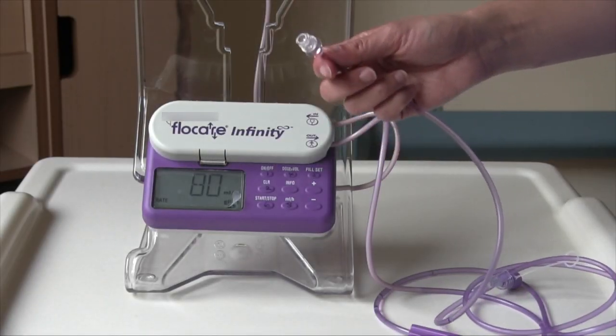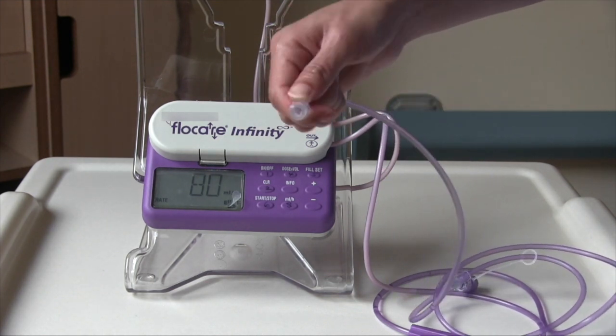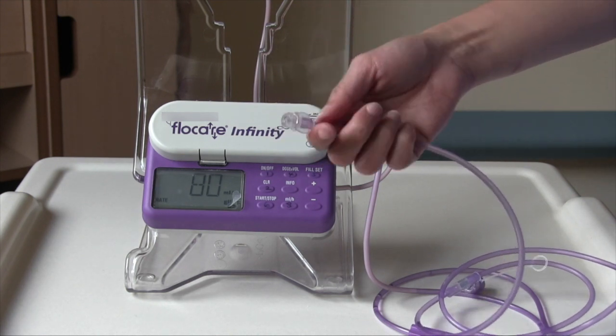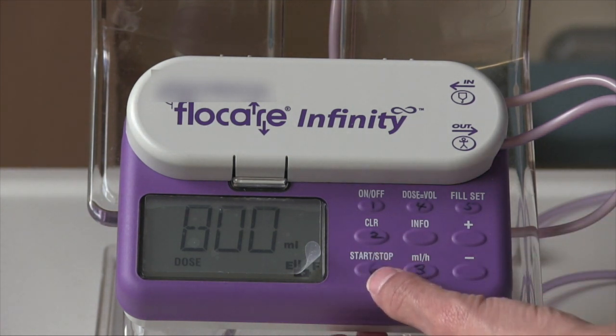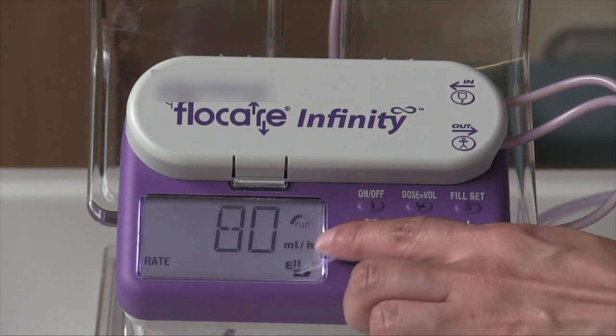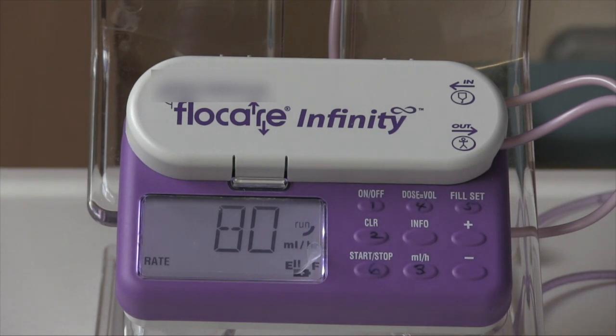Once the cap is off, you can connect the giving set to your feeding tube. To attach it, line the end of the tube to your own feeding tube port and turn to tighten, just as you have been doing with your syringes. Once you've attached the end of your giving set to your feeding tube, you can now run your feed by pressing the start-stop button here. So you'll hear a beep, and you'll see there's a run circle which indicates that the feed is going. It will deliver a few drops at a time, so it's normal for the machine to pause.